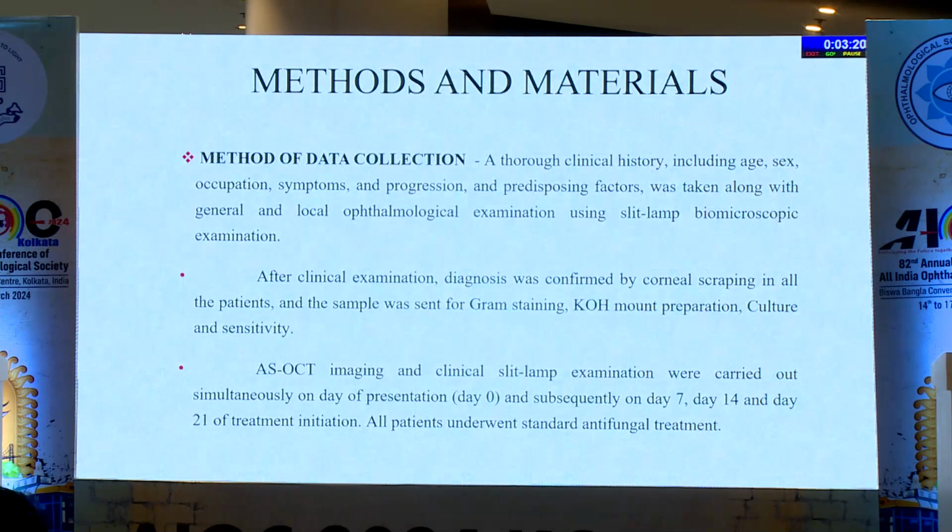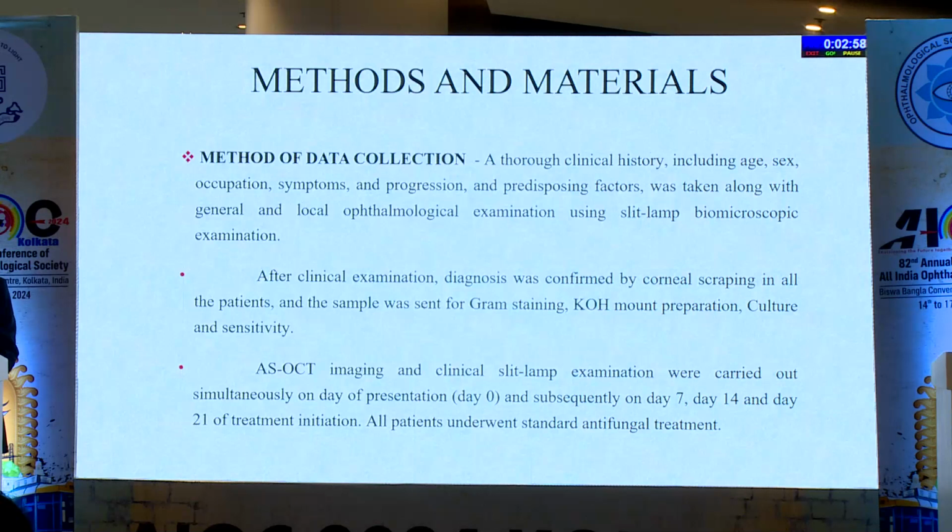As a method of data collection, a thorough clinical history including age, sex, occupation, symptoms, and progression was taken, along with general and local ophthalmological examination using slit lamp examination. Clinical diagnosis was confirmed by corneal scraping in all the patients, and the samples were sent for gram staining, KOH mount preparation, culture and sensitivity. ASOCT imaging and clinical slit lamp examination were carried out simultaneously on the day of presentation, and subsequently on day 7, 14 and 21 of treatment initiation.